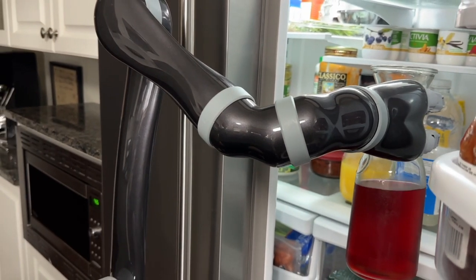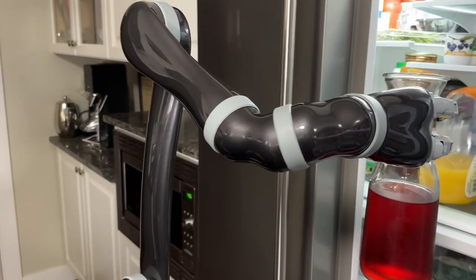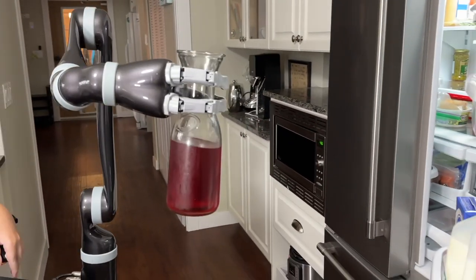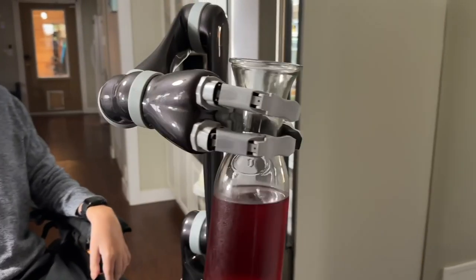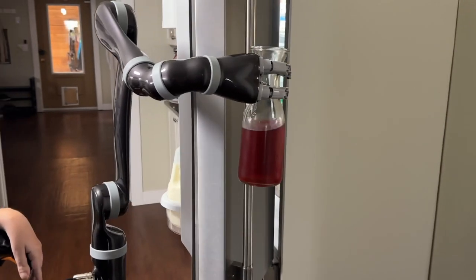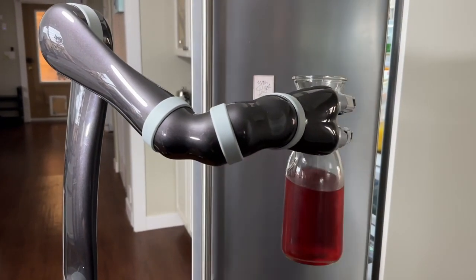Instead of moving Jayco, I'm just going to move myself in my chair. A quick thing you can do to save some time is use your hand that's already out to close your refrigerator. So I'm going to get in behind here and just give the fridge door a little tap with Jayco's hand — and there it goes, closed.